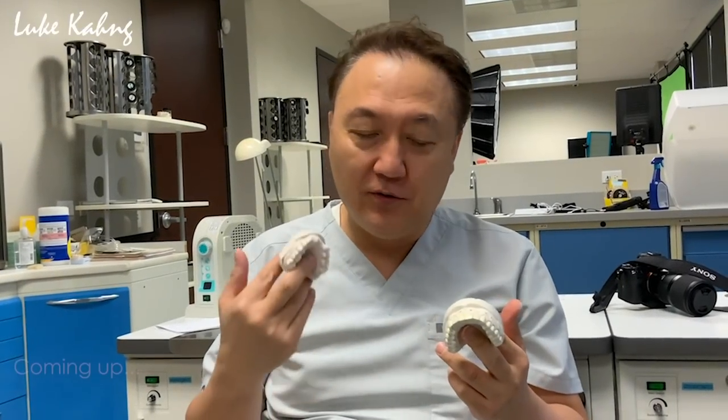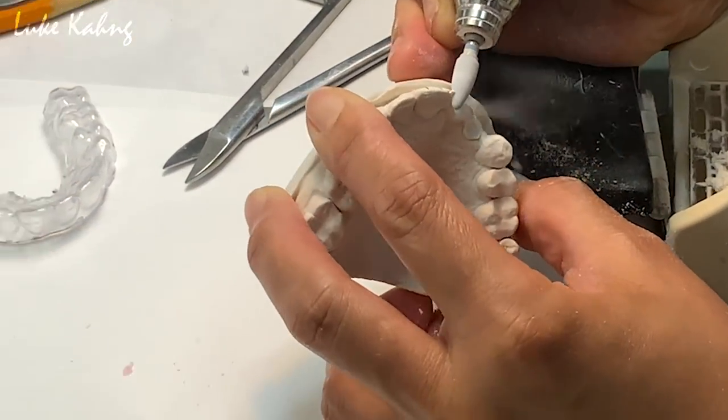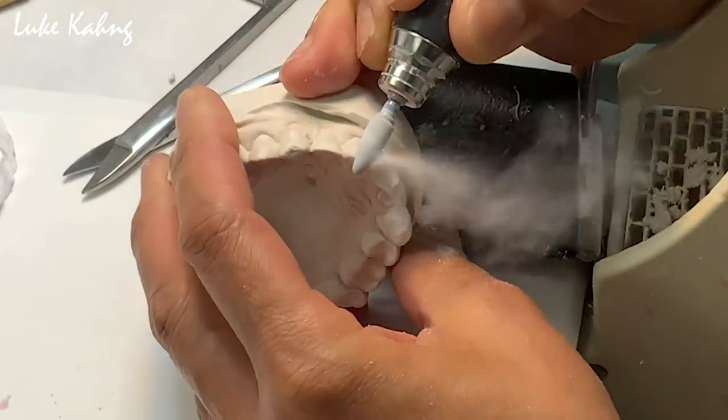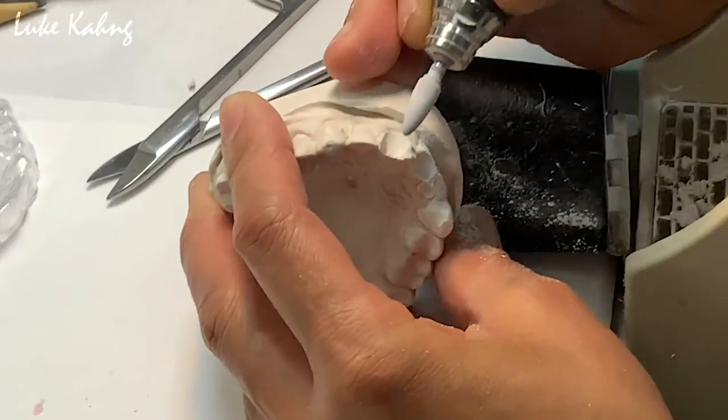Today I would like to show you about laboratory processing. For someone who doesn't have any teeth, or when the doctor has to pull out teeth, they need a temporary, right? Everything's there, the teeth are there, but three teeth have to be taken out, and they need a temporary. But you can do so many things.